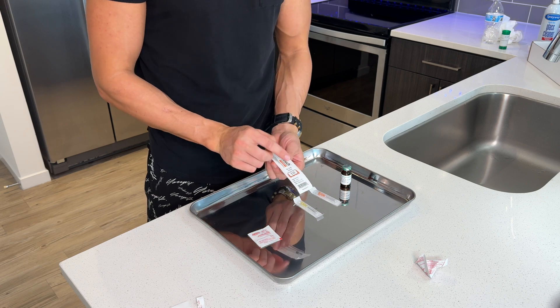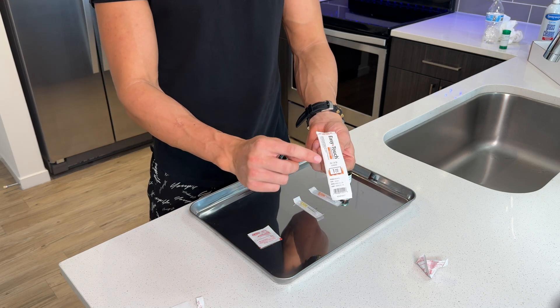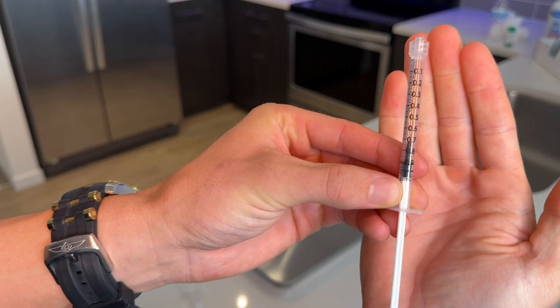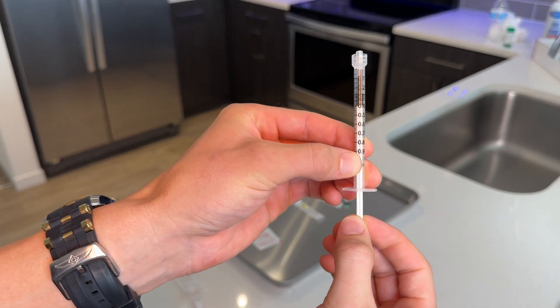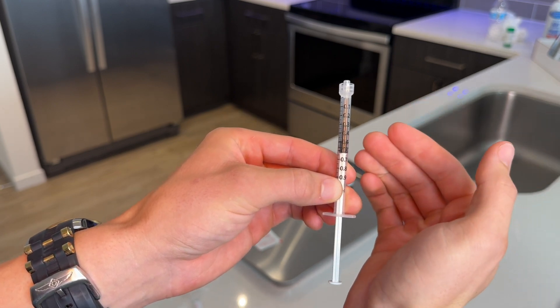We're gonna get our one cc or one milliliter syringe ready. It's also important to note that one cc is equal to one milliliter — they are the same thing. So we're gonna go ahead and open it up. As you can see, there are different measurements all the way from 0.1 up to one full cc. For today's example, we're gonna be pulling back the syringe to 0.5, which is 100 milligrams of testosterone.